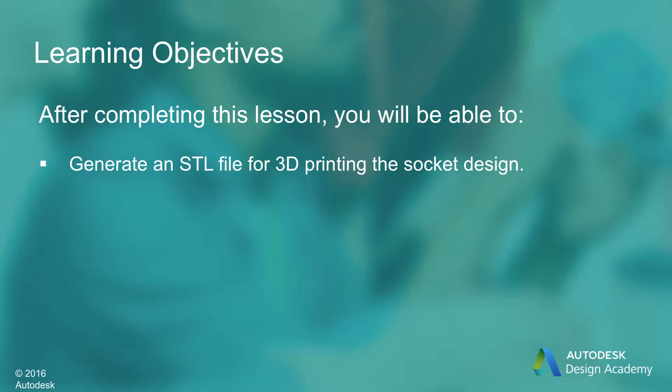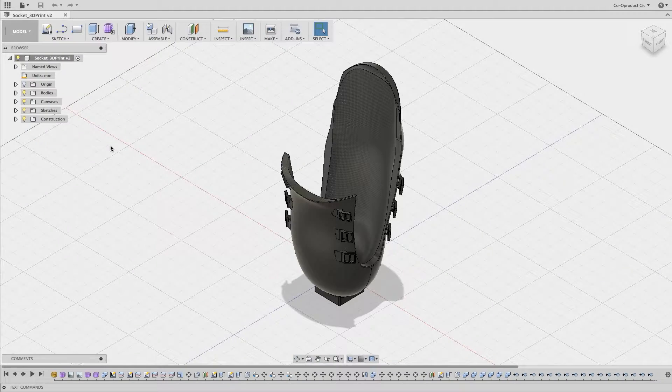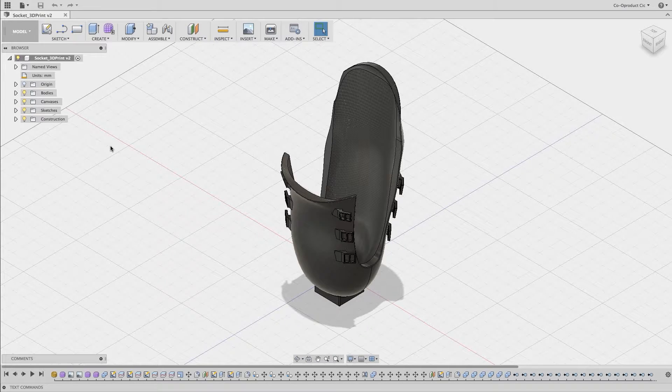After completing this lesson, you'll be able to generate an STL file for 3D printing the socket design at 1 to 1 scale. Our second 3D print software tutorial focuses on 3D printing the Humore Prosthetic socket at 1 to 1 scale.